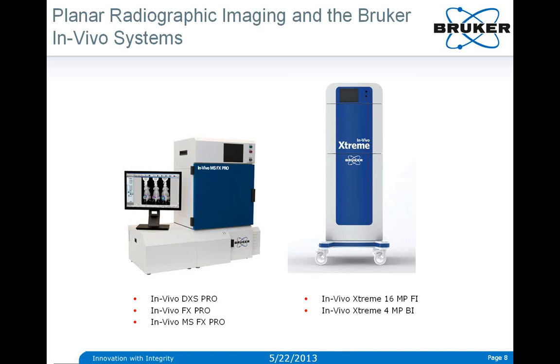The different systems are depicted here. To the left, the DXS Pro, FX Pro, and Multispectral FX Pro. The systems are modular, so the user can add modules that suit the application requirements for their research. All of the systems are equipped with animal heaters and porting for gas anesthesia. And to the right are In-Vivo Xtreme systems. The 4 megapixel system provides for maximum sensitivity.